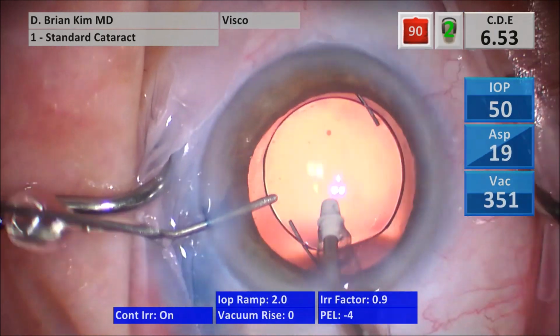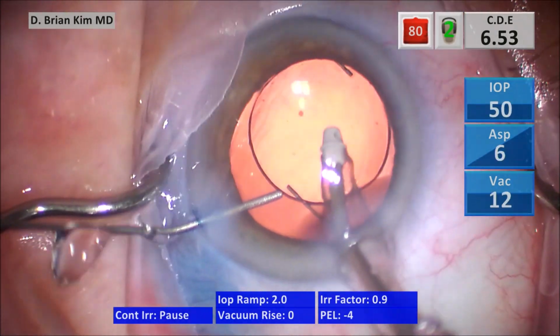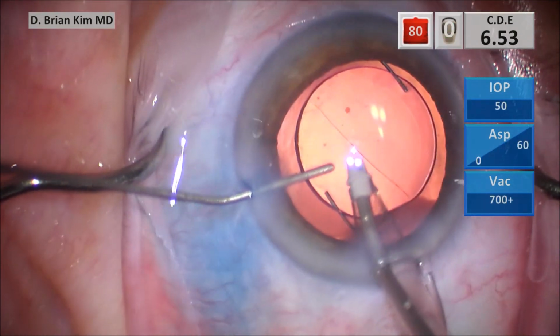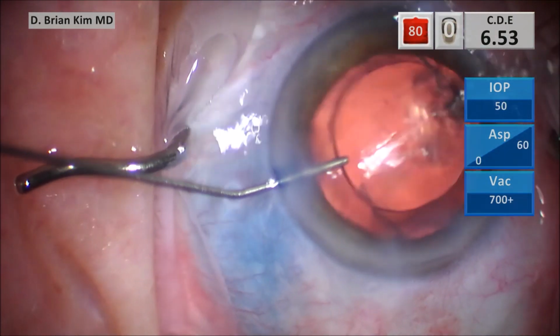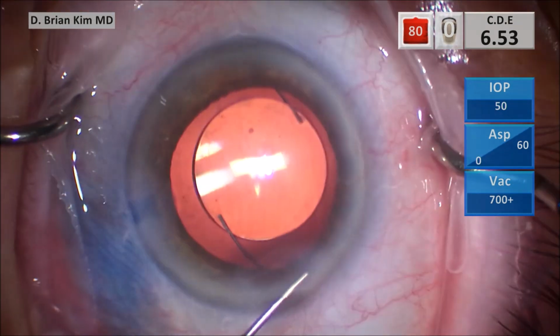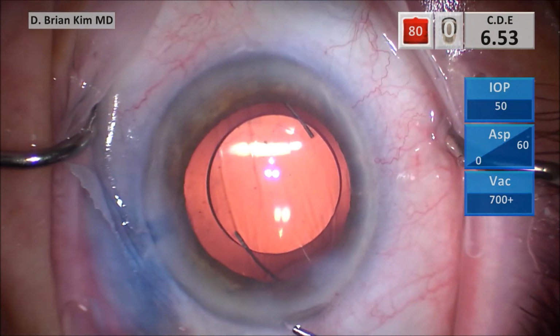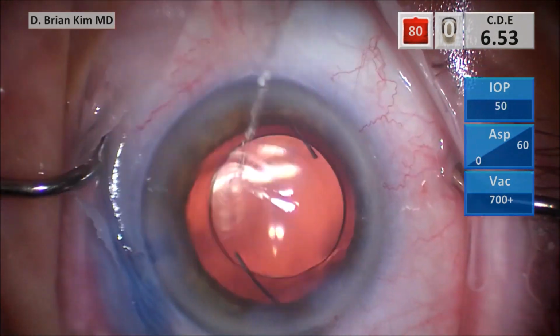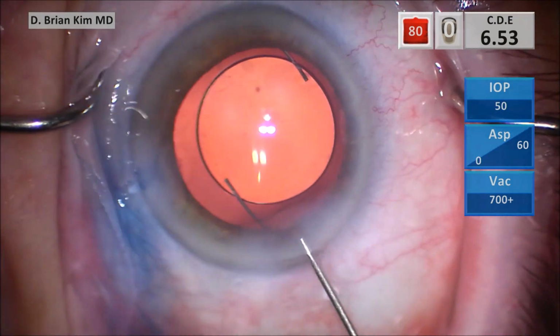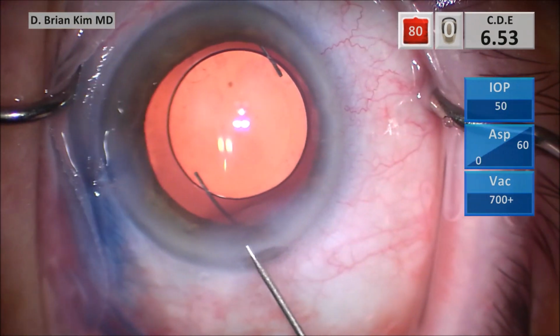I use sparing amounts of ultrasonic energy, as well as sparing amounts of vacuum, which, again, with this type of dense lens, the posterior capsule wants to come up. There tends to be more zonulopathy. And because of those factors, I feel like this is really a very safe way to disassemble hypermature lens, again, exposed posterior capsule, as well as potential zonulopathy.